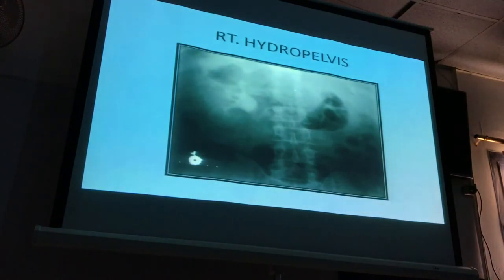You can see here, this is intravenous pyelography. The left side is normal. The right side shows severe hydronephrosis. What are the causes of hydronephrosis? Tarafa? Yes, hydronephrosis. Stone, maybe stricture.